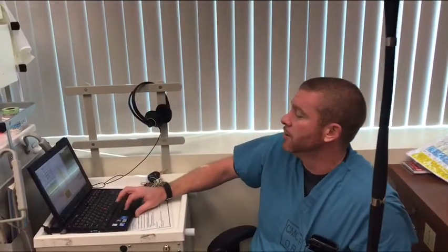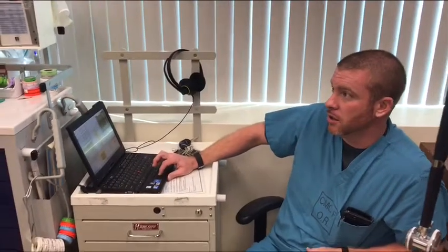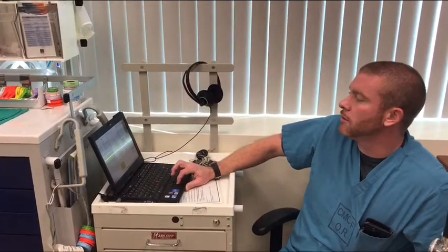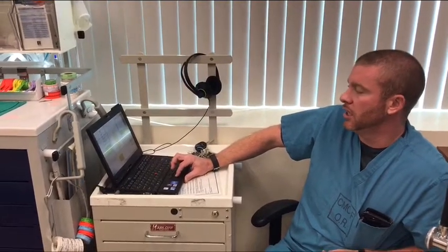You caught it probably because you were seeing it. That's what I'm saying. Train your ear to hear that. When I'm talking to you that whole time, you better know your procedure. When you're hearing this flow and stuff, you don't need to be conversating with anybody. You need to be paying attention to what's going on, because you just got an emergency and you didn't even recognize it. And that's okay. I didn't hear it. I know you didn't. You guys will learn.